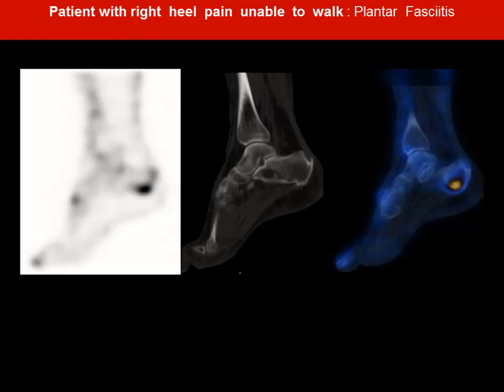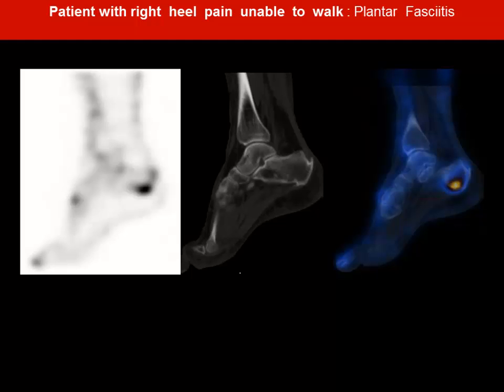This is again a patient with fall and persistent heel pain. There is an osteophyte as well as focal uptake at the site of the plantar fascia, typical for plantar fasciitis on a bone scan. If you want accurate localization then SPECT-CT helps, but otherwise this pattern can be easily diagnosed on a two-phase bone scan or even on a planar delayed image.